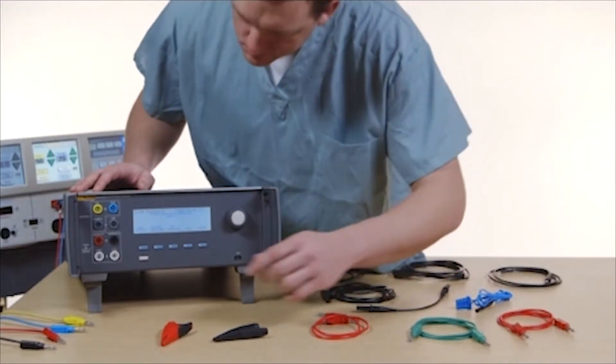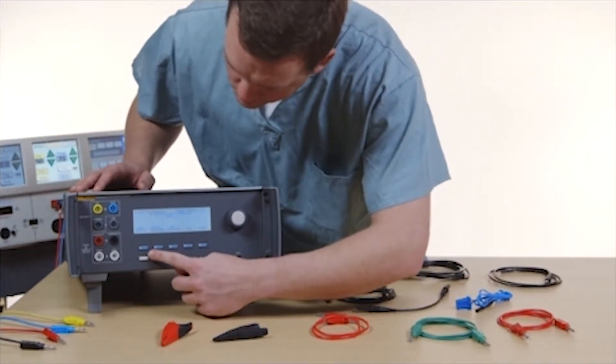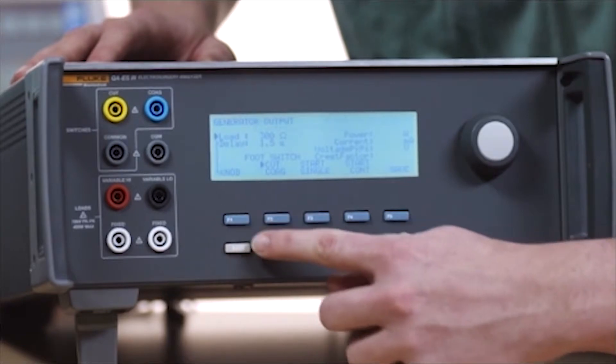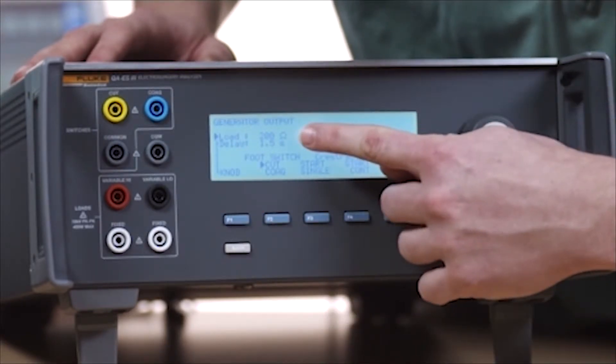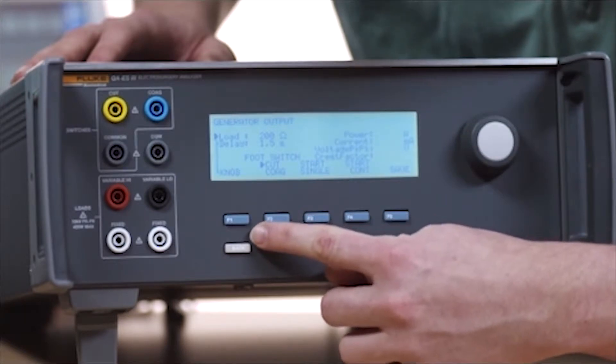To perform a generator output test in monopolar mode, push F1 from the menu. Turn the rotary knob to set the load resistance. 200 ohms is recommended.